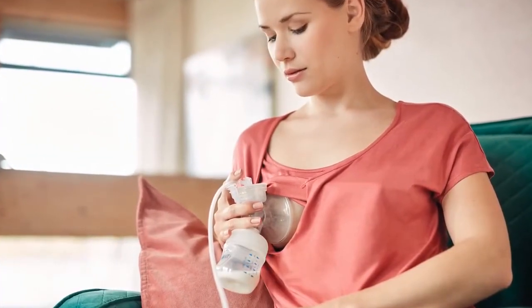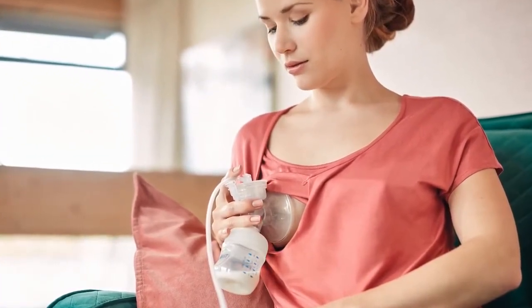Place the assembled pump against your breast, ensuring your nipple is centred so that the massage cushion creates a firm seal. The Philips Avent Comfort electric breast pump allows you to lean back whilst expressing, so you're more comfortable and can produce more milk.